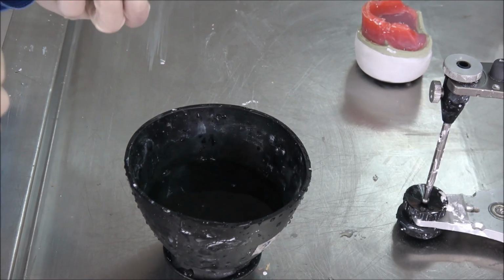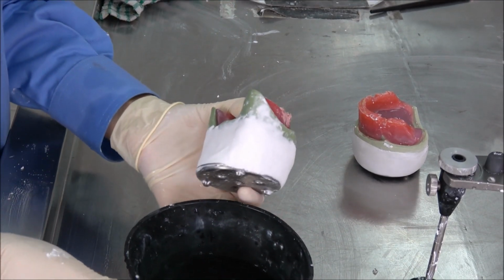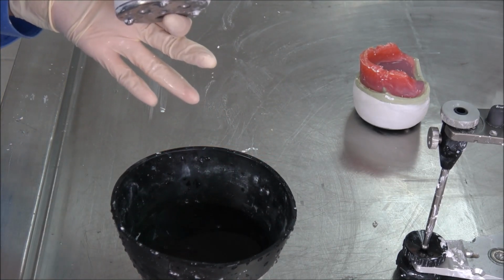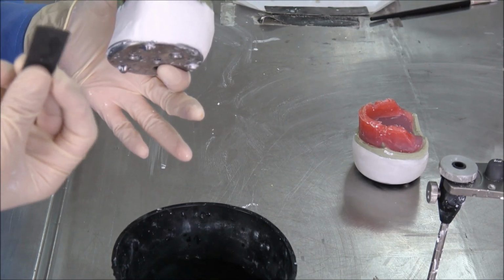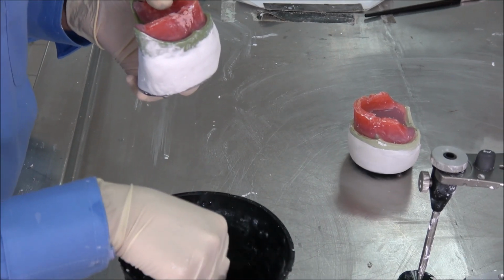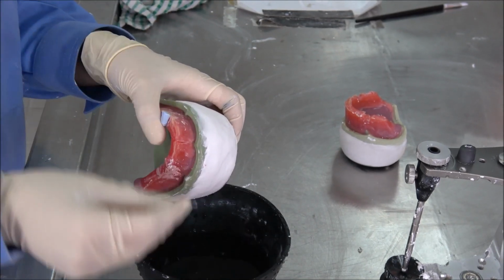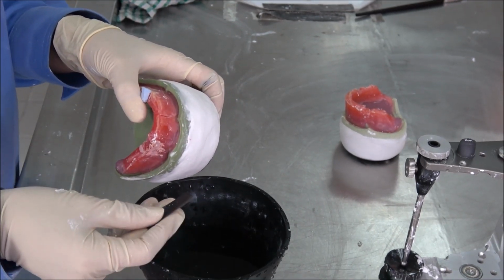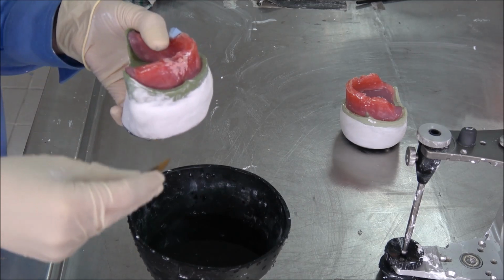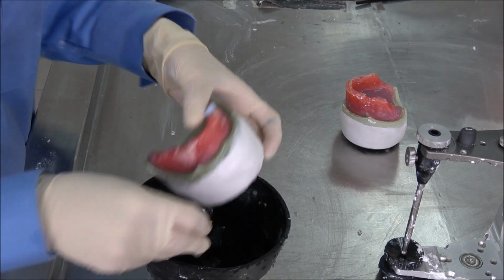Okay. Once we are done adding our POP to cover the area, everything is okay. So we get ready one bowl of water, okay, for sandpaper purpose. So we use one piece of sandpaper here, okay, for one model. So we attach our sandpaper, and we use our water. Use your sandpaper with water, because a lot of students when doing the study model, they just use sandpaper only. So you better use it with the water. It's more smooth. Okay. So just sand it.